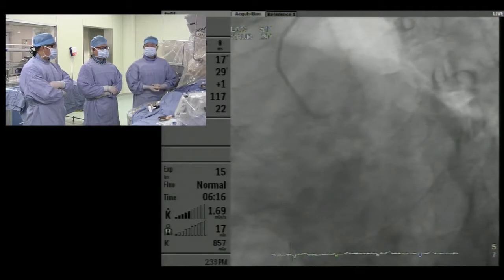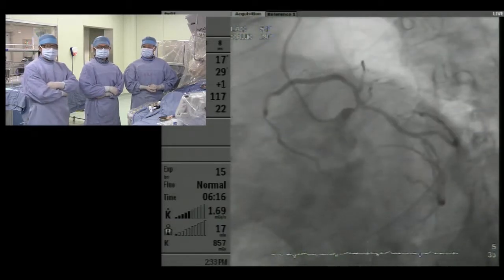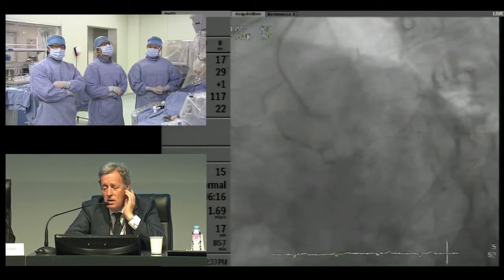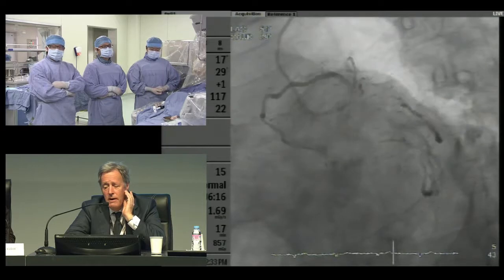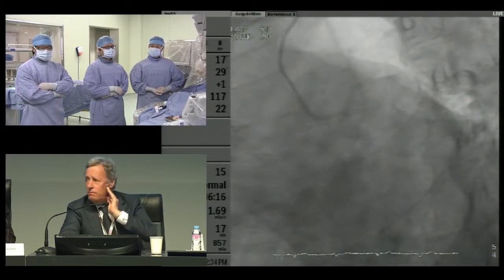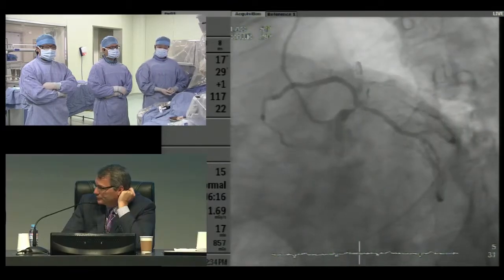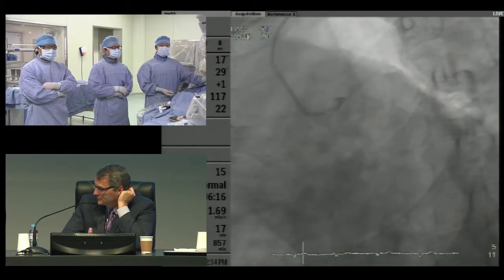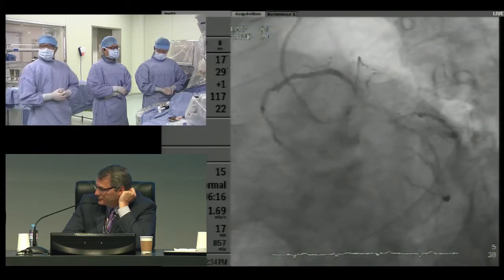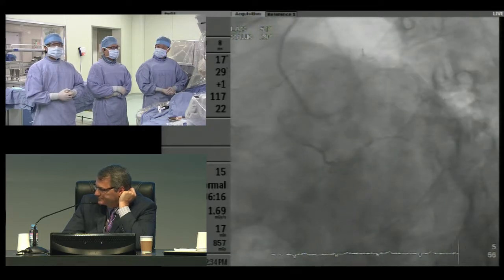Thank you. I was about to ask the panel's opinion. From the data so far, personally, I think one-stent strategy is most of the time the best strategy, but seeing the severity of the lesion, I would prefer a two-stent strategy here. Anyone who has other thoughts in the panel? You have a fairly young patient who is a candidate for both bypass surgery and PCI, so we'd like to offer an equivalent strategy with physiologically complete revascularization. Before we micro-focus on the left main, we would need some physiologic assessment of the distal circumflex and the right coronary artery to decide how much work needs to be done today in terms of the left main. A two-stent strategy makes perfect sense.